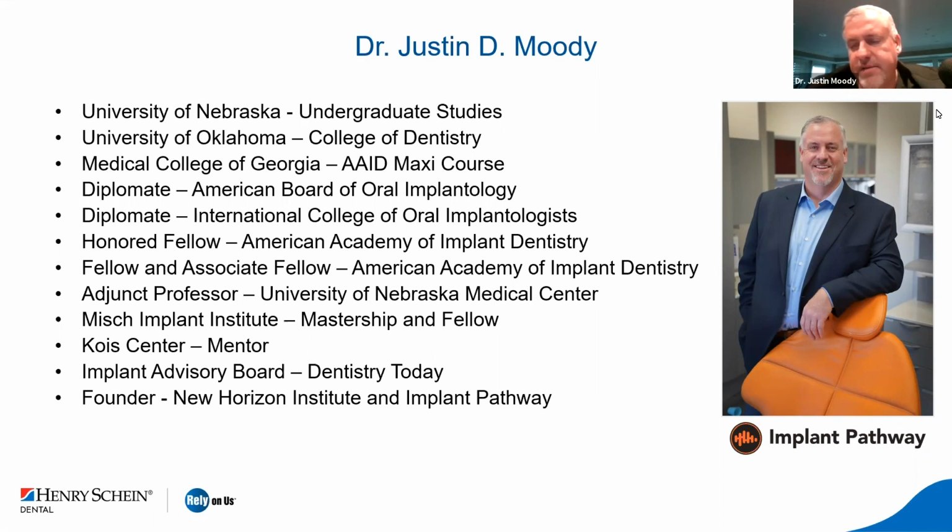Now, not every implant can be surgically guided, and not every surgical guide should be used. But for aesthetic zone implants, single units, and even some edentulous arches, it can be a great tool for increasing efficiency. So I want to talk a little bit about how we work these technologies into the practice, and hopefully at the end you have some questions for us along the way.